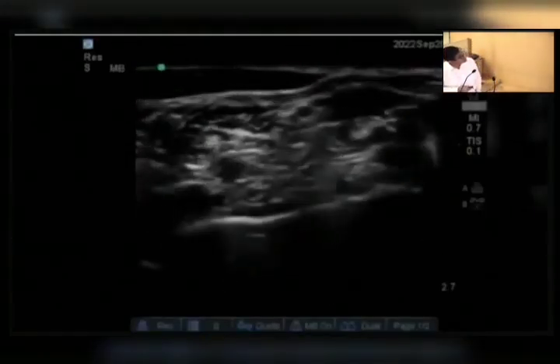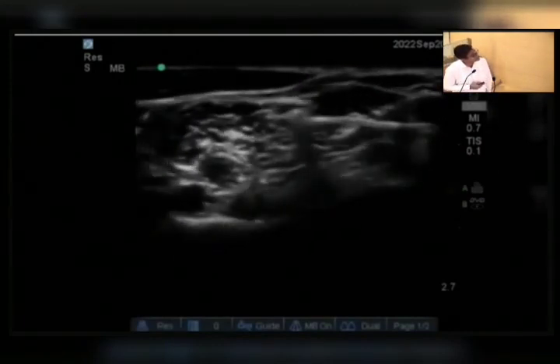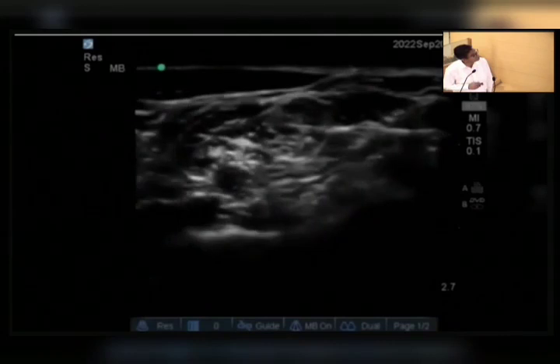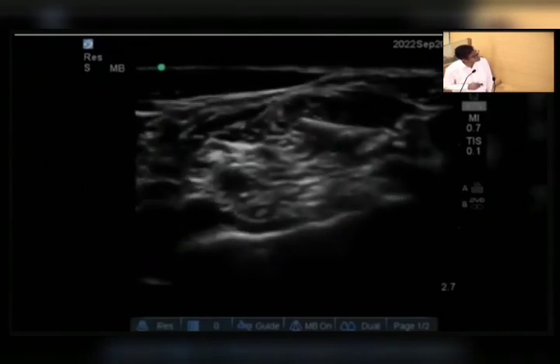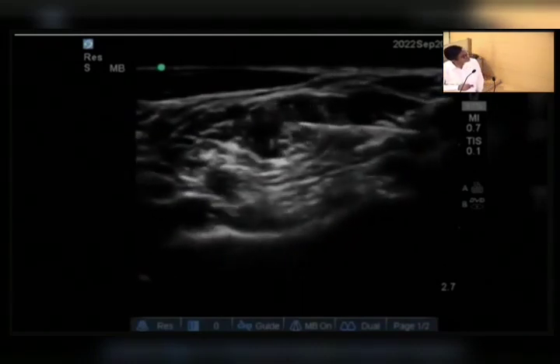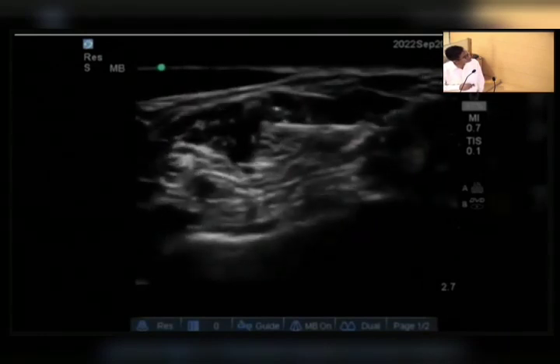See, the technique is almost the same, but at the level of the superior trunk, and the drug is distributed in between the sheath and superior trunk over here. And see, all the superior trunk has been covered with local anesthetic. This is the subclavian artery which is giving a branch over here, and this is the middle trunk. This is the upper trunk.